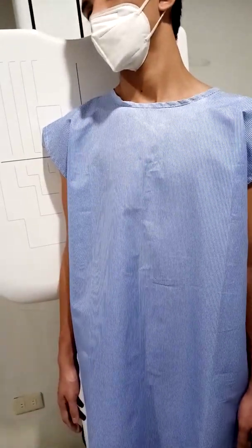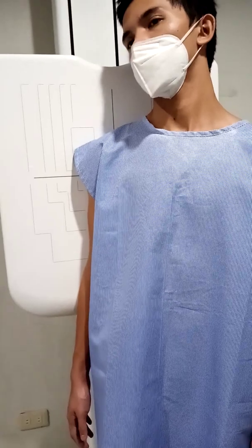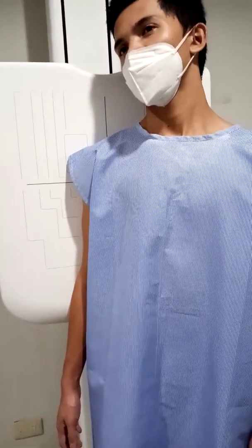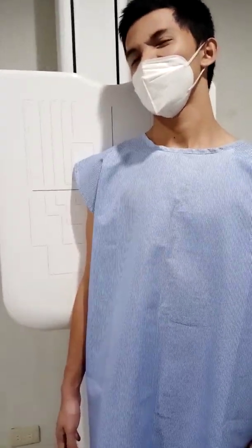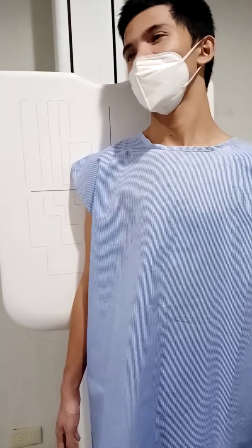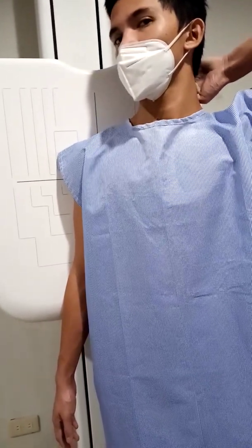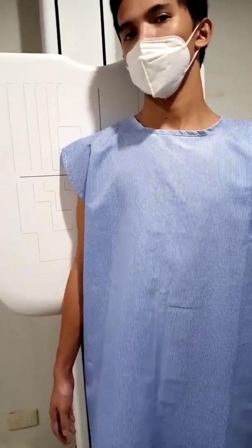Next one is the SID that we will use is 40 to 44 inches or 102 to 113 centimeter. Then the collimation, so the upper and lateral borders of the field are to the soft tissue margin. So always leave 1 and 1/2 inches in the collimation.